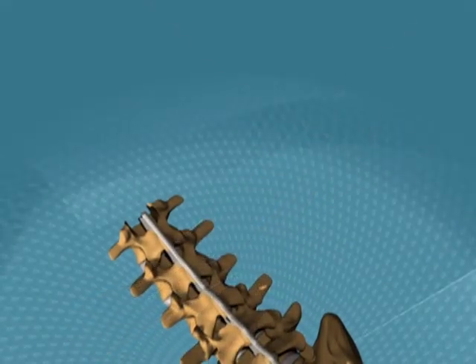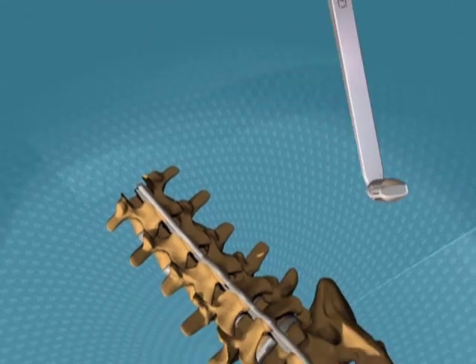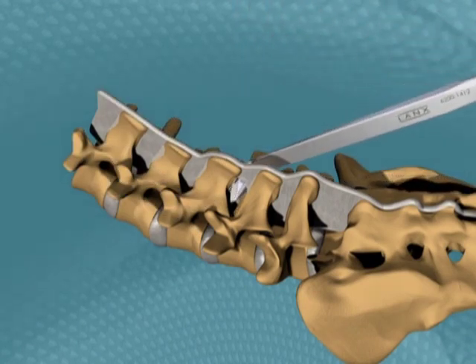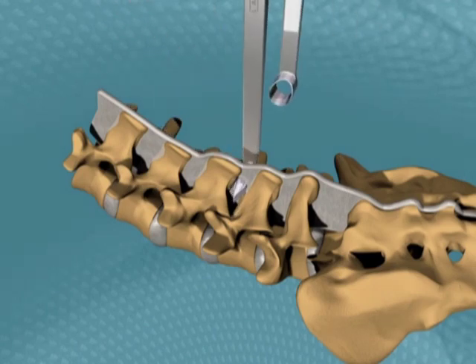Using the size indicated by the spreader, attach the corresponding size rasp to the gray handle. Insert the rasp into the interspinous space and rotate the instrument cephalad to caudad, decorticating the spinous processes.